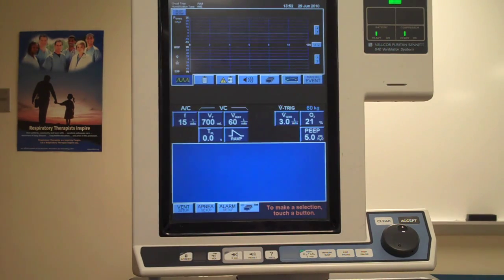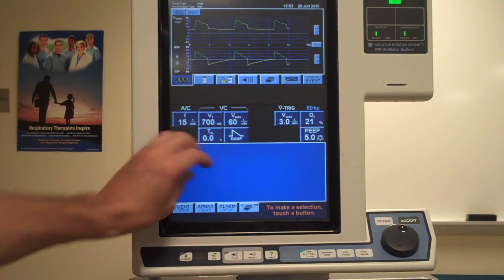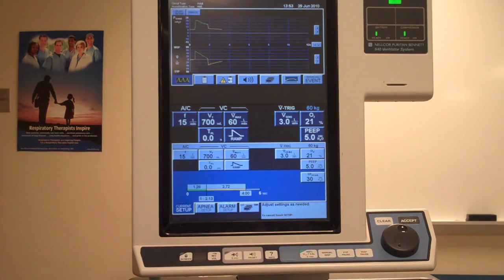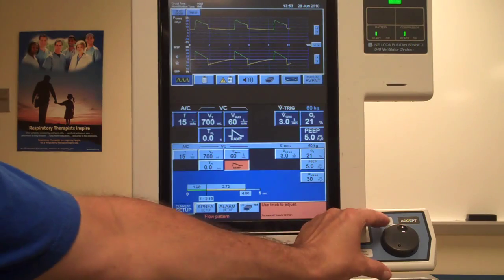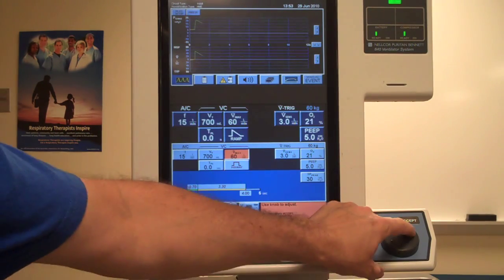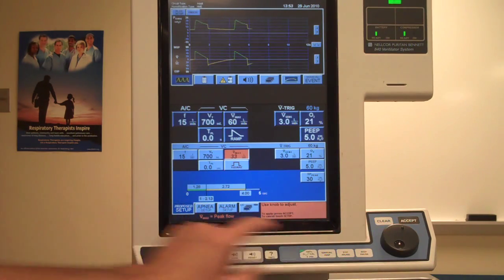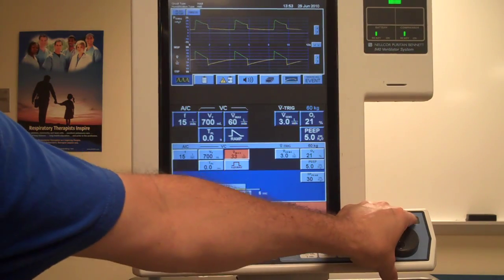To do a static compliance measurement, we have to be in a situation where we have a square wave flow pattern. The simplest method is using the sandbox at the bottom — touch vent setup and continue. I can now create the desired settings: I want a square wave flow pattern while keeping my inspiratory time at 1.28 seconds. To do that, I need to reduce the flow so it shows a 1.28-second inspiratory time at 33 liters per minute. Now I hit the accept button.